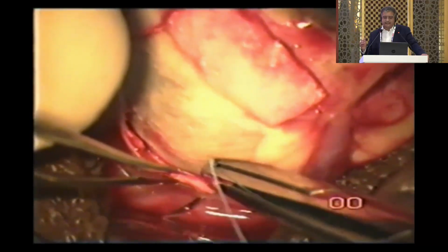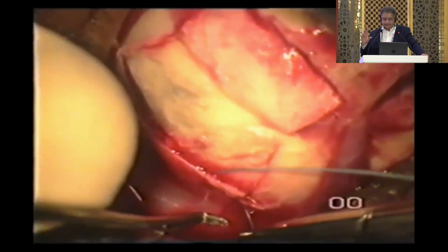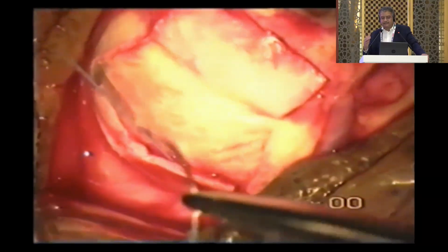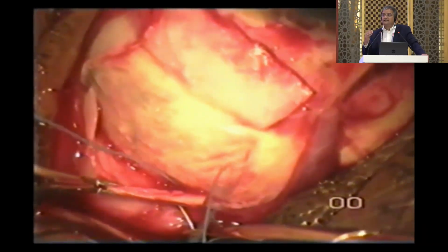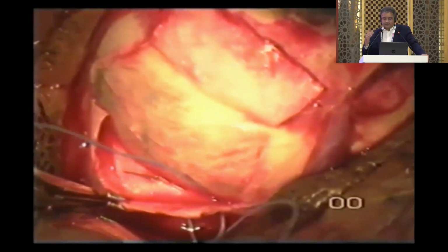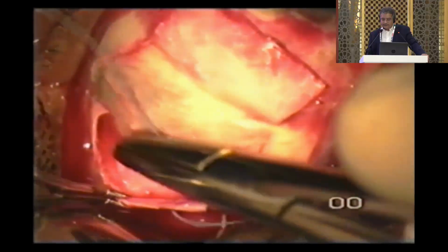Very elegant surgery. You can actually, based on the dimensions of the buckle used, dissect the sclera and then pass the sutures. This also helps in the choroidal drainage because you have a very thin scleral bed. But obviously, it's more time consuming.